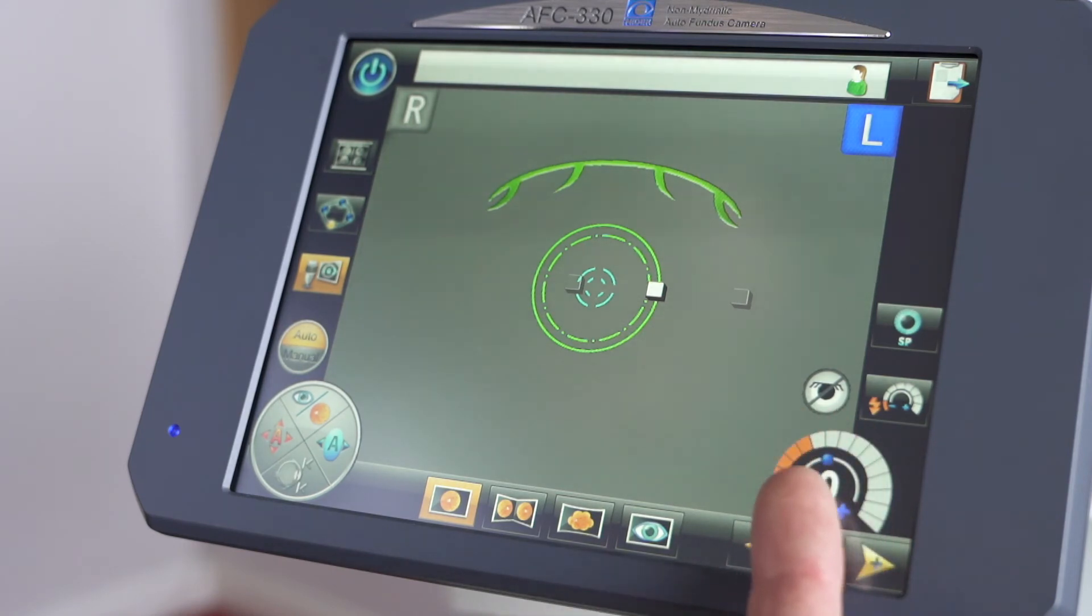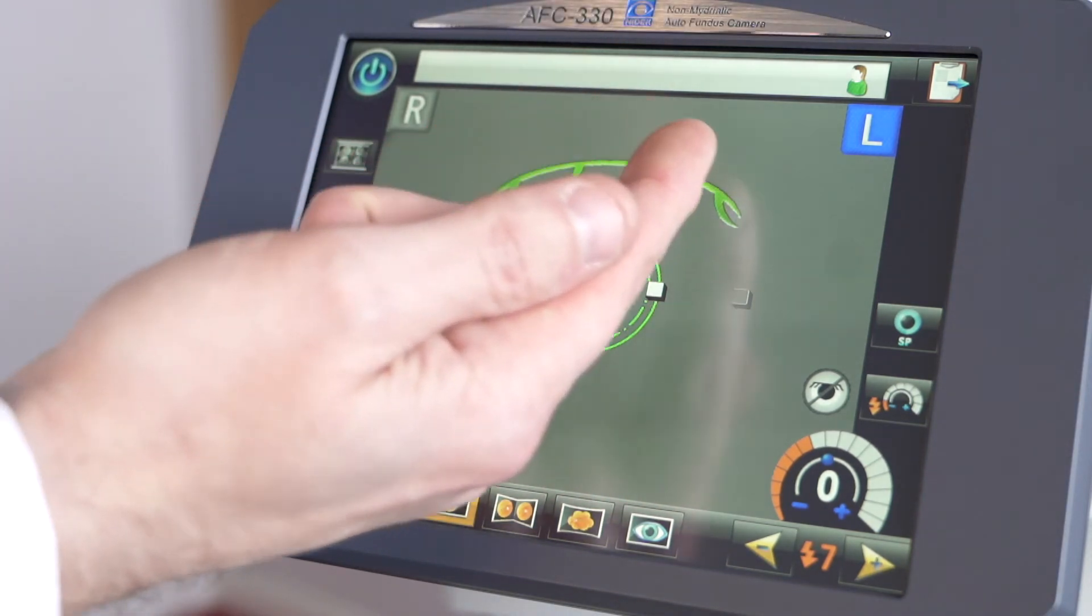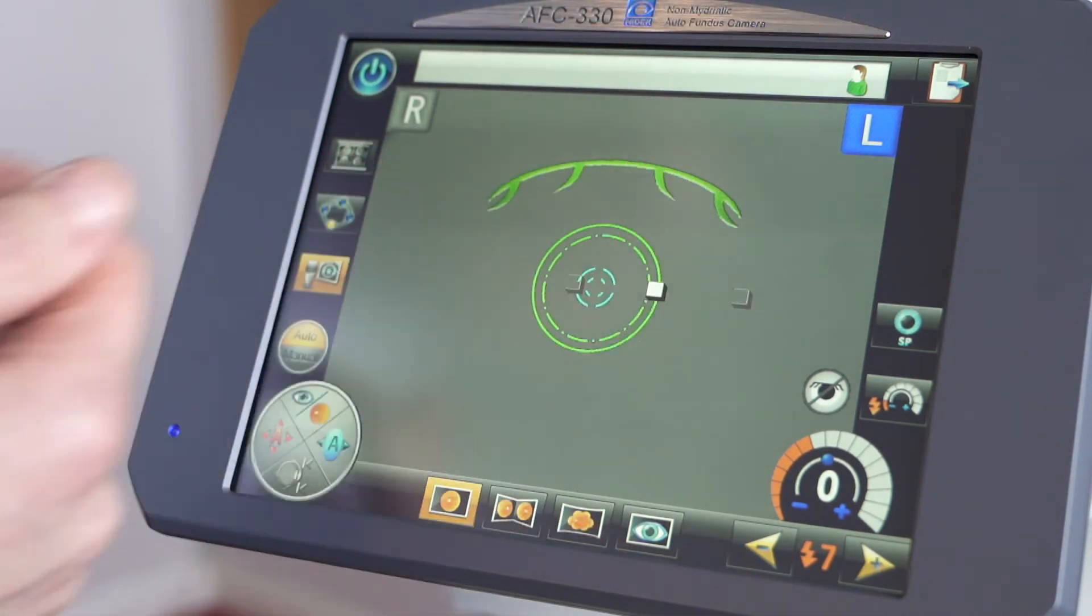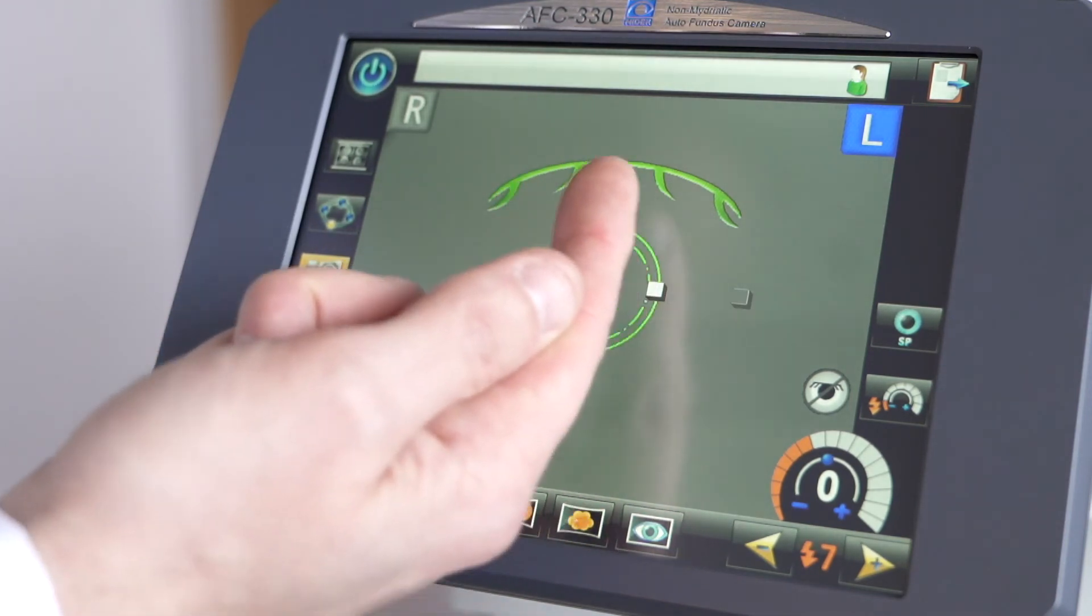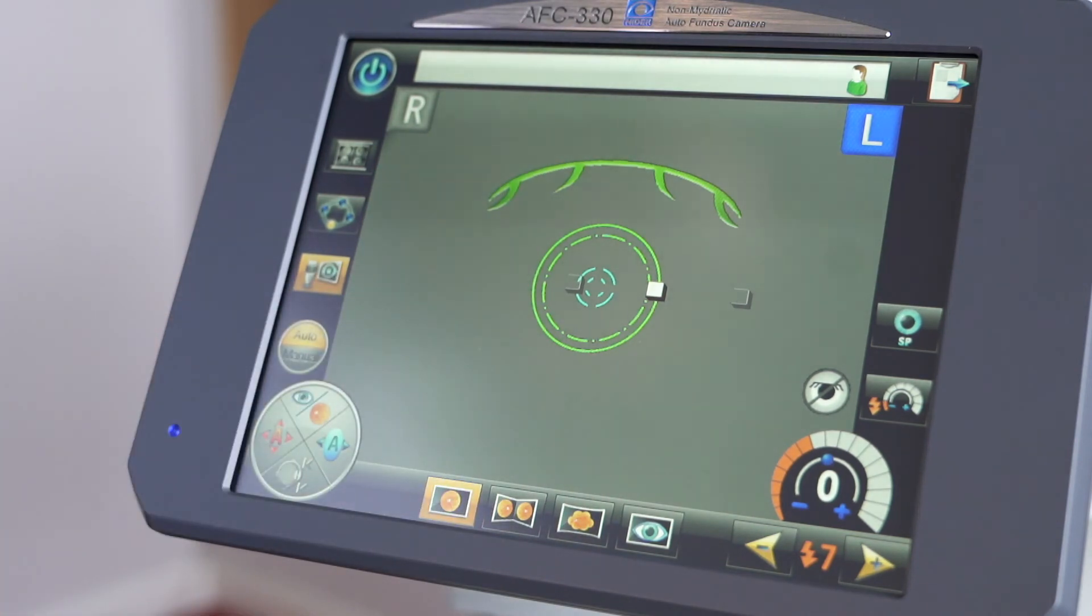Here we have an indication of the focus power needed to actually take the photo. On the screen itself, this is an indication of the eyelids. And then we have two circles to give an indication of the pupil sizes.